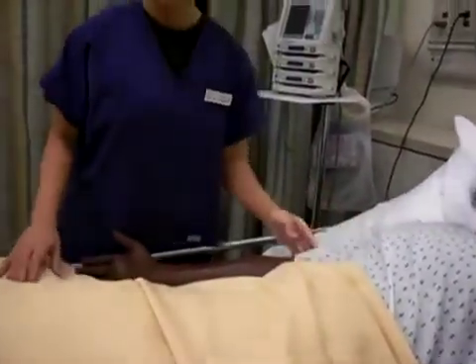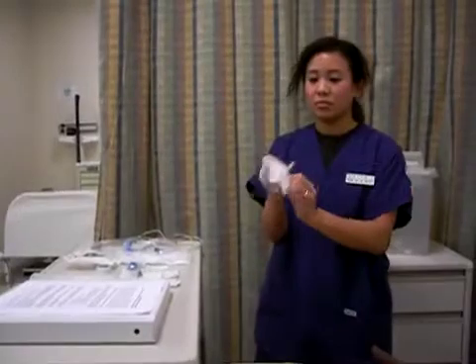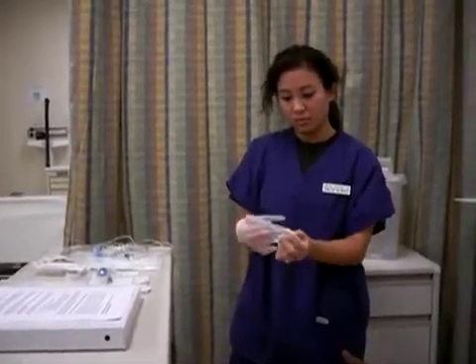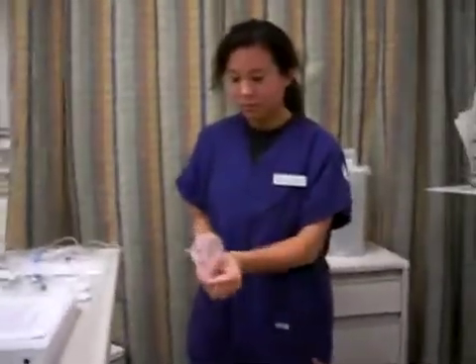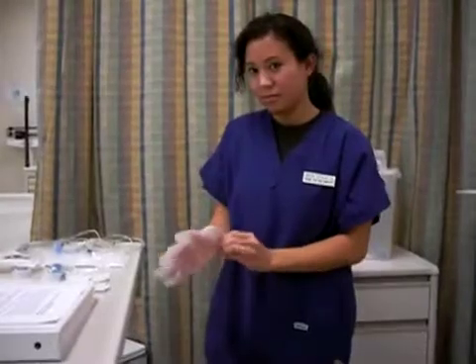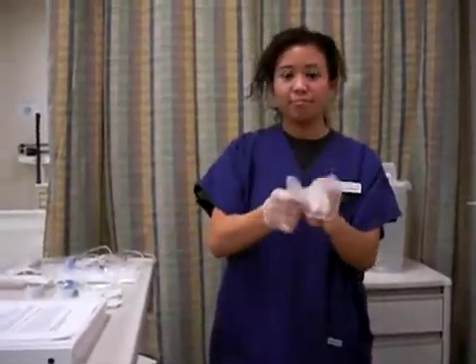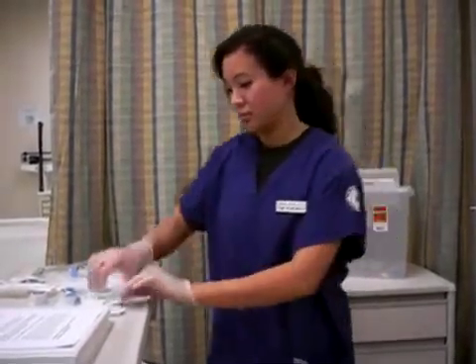Hand hygiene was performed again and new gloves are applied. Equipment such as IV start kit, IV catheter, alcohol swabs is organized on a clean bedside table. The nurse opens the sterile IV start kit and prepares for IV infusion.